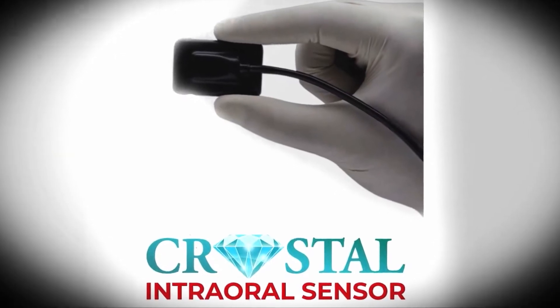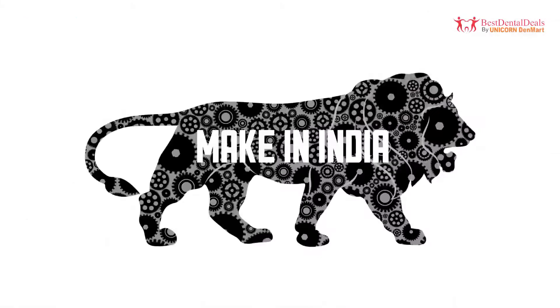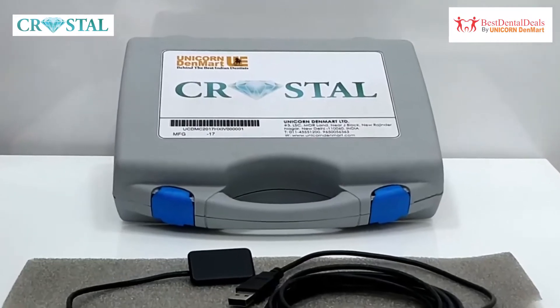Introducing the Imaging Oral Digital Sensor Crystal RVG — the first RVG to be manufactured in India. Let us take a look at this superior sensor and what it has to offer.